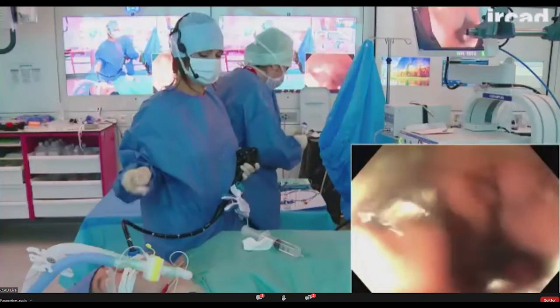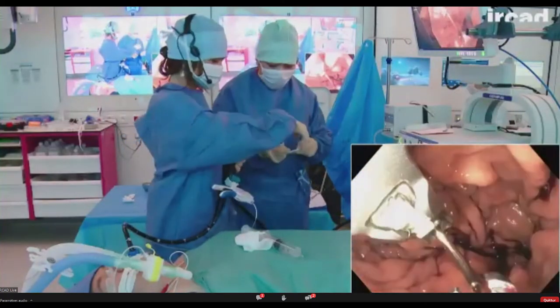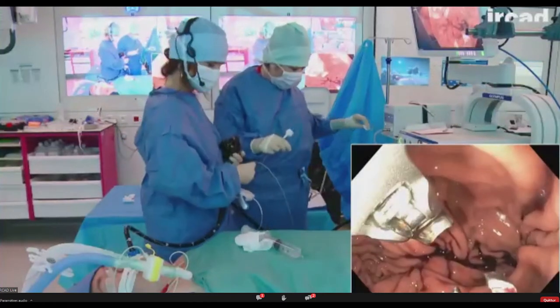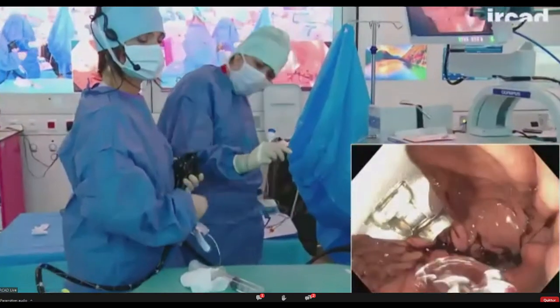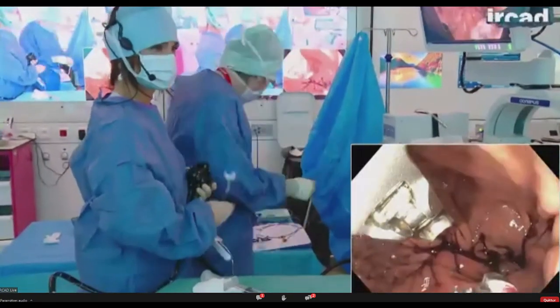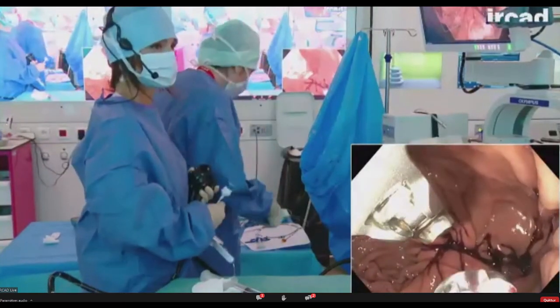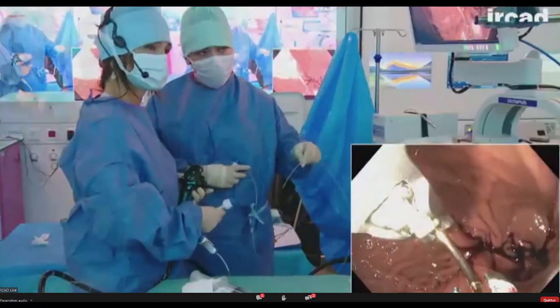And the other that's very important: how long does the suture last? We have heard this question so many times, Lee and Silvana. The suture doesn't matter. What matters is the serosa to serosa apposition. So Silvana and Lee, feel free to comment on that, because this is a very, very present question. How long does the suture last?